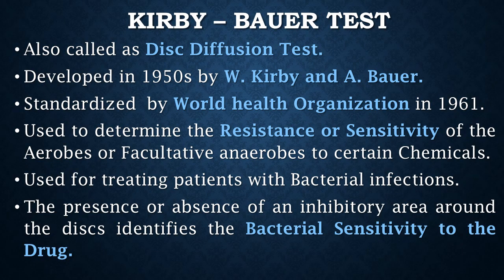Kirby-Bauer method. It is otherwise known as a disk diffusion test. It was developed in the 1950s by W. Kirby and A. Bauer. It was standardized by the World Health Organization in the year 1961. It is used to determine the resistance or the sensitivity of the aerobes or the facultative anaerobes to certain chemicals. It is used for treating patients with bacterial infection. The presence or the absence of an inhibitory area around the discs identifies the bacterial sensitivity to the drug.